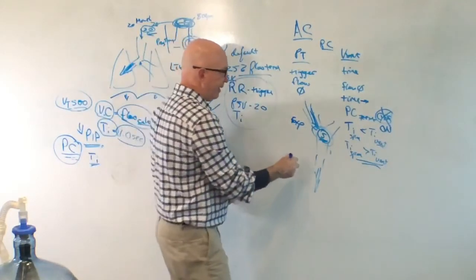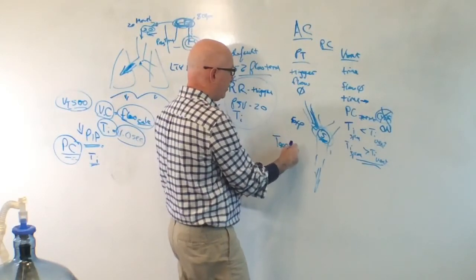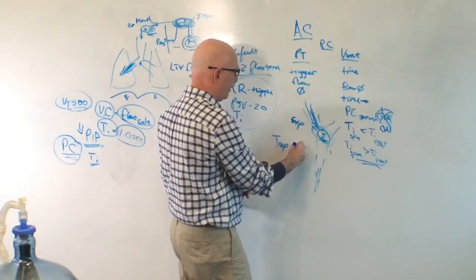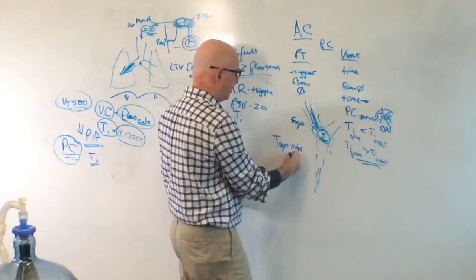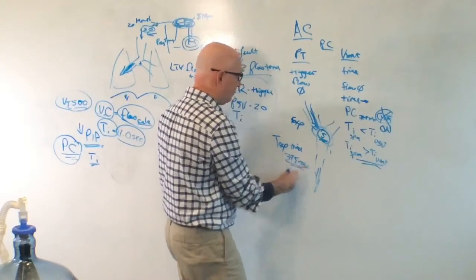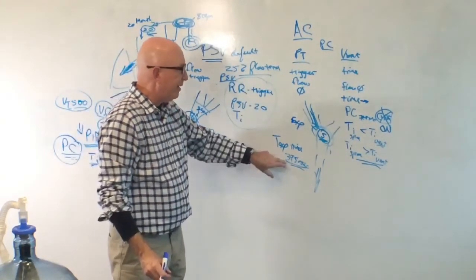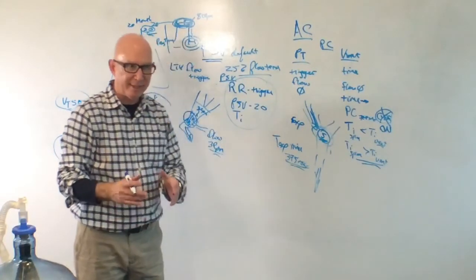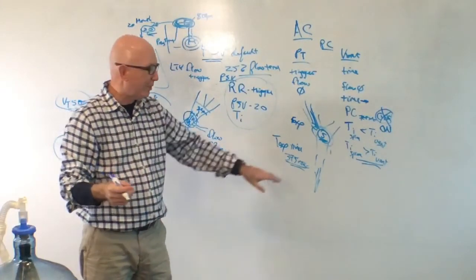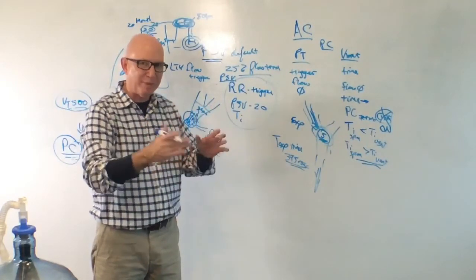The other way is that once you exceed the mandatory expiratory time, and I think it's 375 milliseconds. What that simply means is that the way the LTV is designed is that you can never have less than 375 milliseconds between a breath, which seems quite short, and it is. But what it simply says is that it'll always allow some time to get that air out.